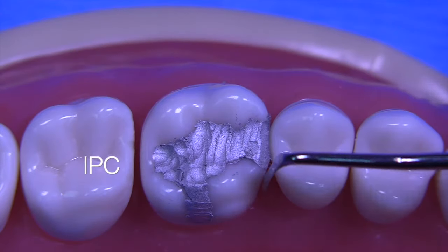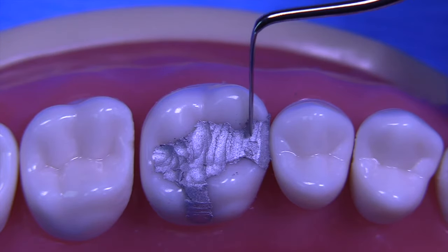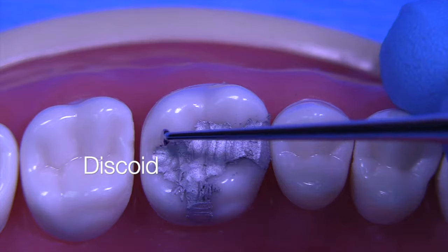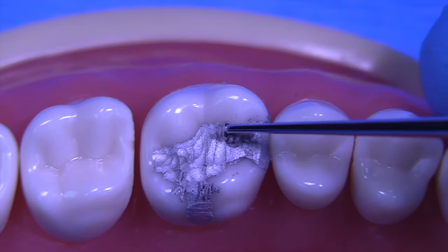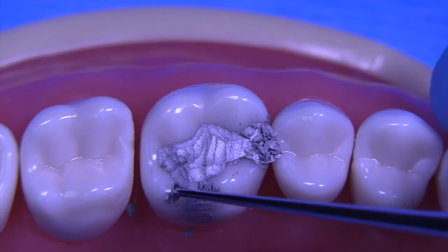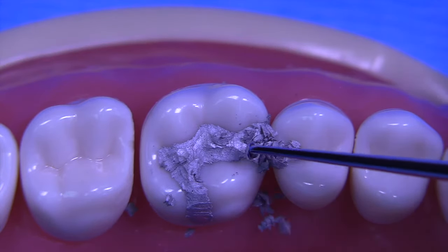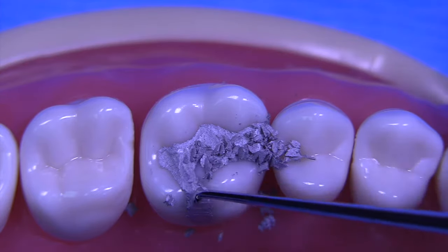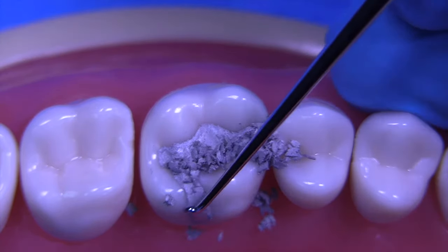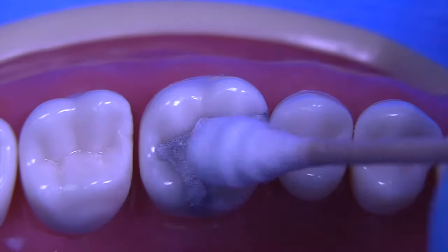Once we have a reasonable contour, we'll use the IPC interproximal carver interproximally to remove any amalgam that is beyond the margin. Then we move on to the discoid end of the cleoid discoid. The purpose is simple: you must find the occlusal surface margin. Use the instrument perpendicular to the margin so you don't ditch it and create a sub-marginal area. The most challenging thing with amalgams is to remember your outline form so you remove all of the flash, while avoiding ditching by utilizing the discoid in this manner.